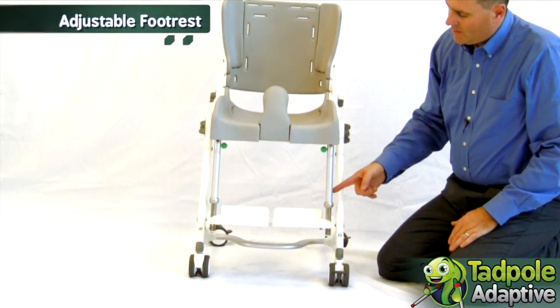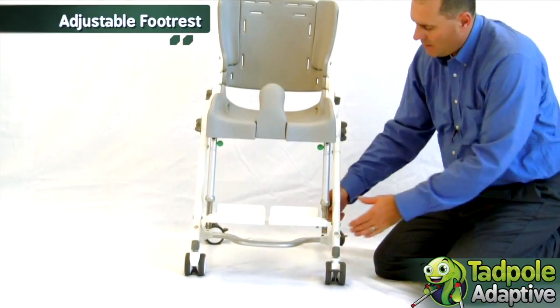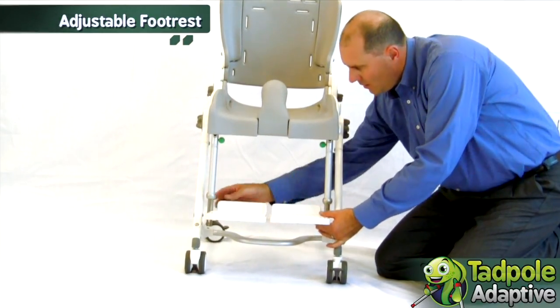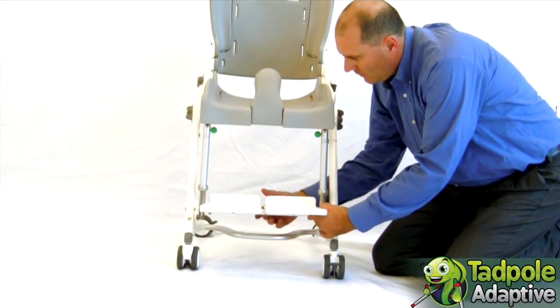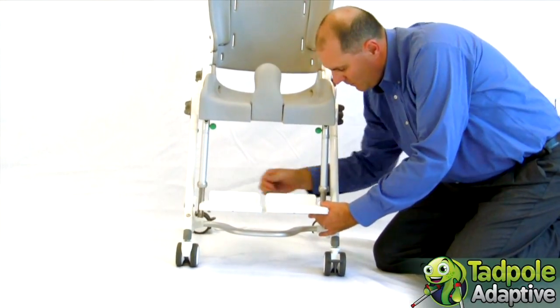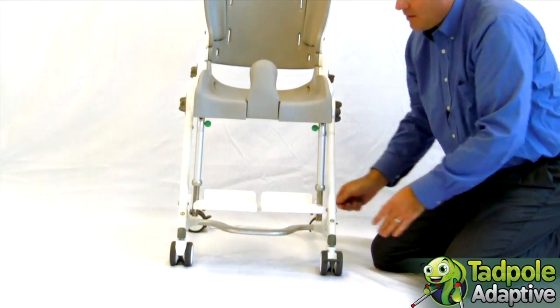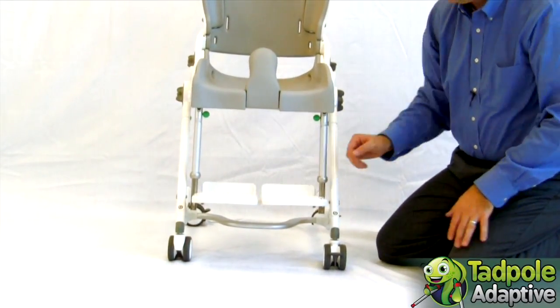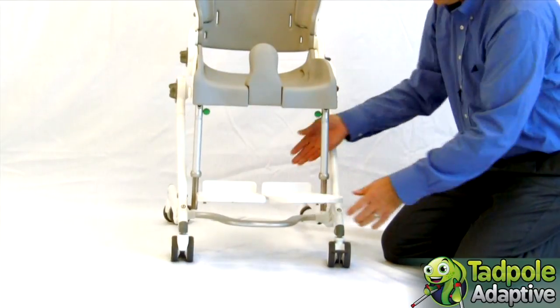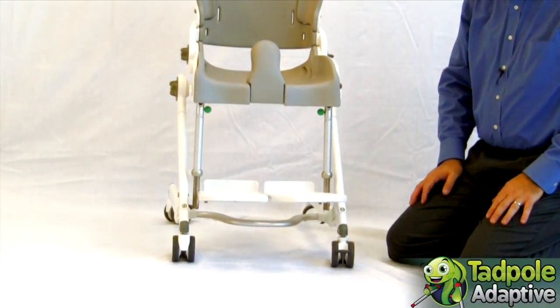The Flamingo also has an adjustable height footrest. The footplate is already molded to receive straps, and they also angle out for comfort in an abducted position.